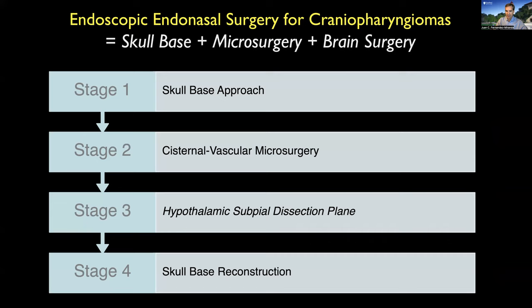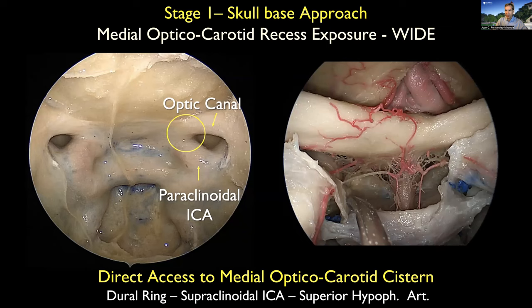For the skull-base approach, it is very important to understand the concept of the medial optic carotid recess. We need to do a wide exposure involving removal of all the bone around the optic canal and paraclinoid ICA. My reference for this exposure is the optic strut. I remove the bone all the way so I have good exposure of the optic nerve and carotid. When I open the dura towards the distal ring and towards the falciform ligament, I can see the optic nerve and carotid artery with the hypophysial branches early in the operation, with no obstruction.